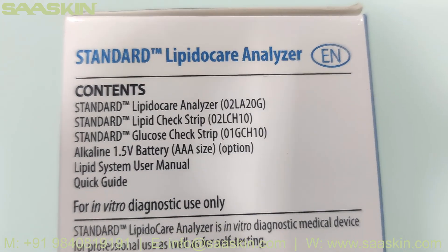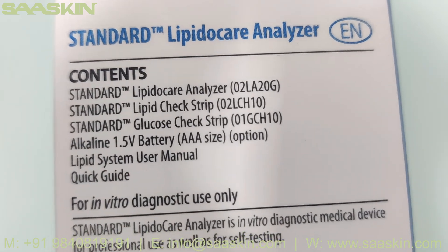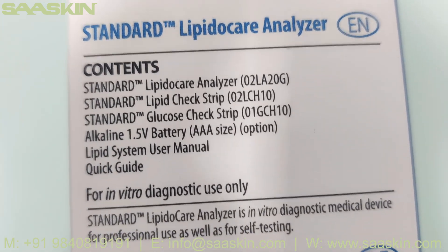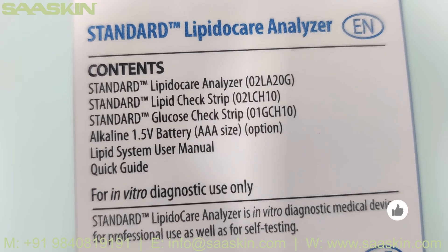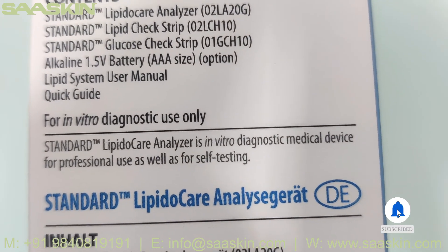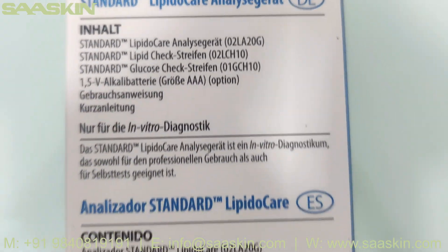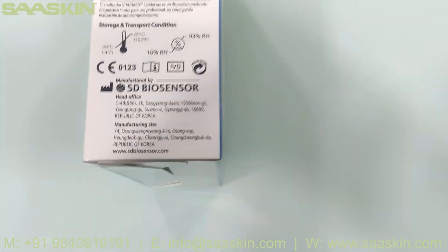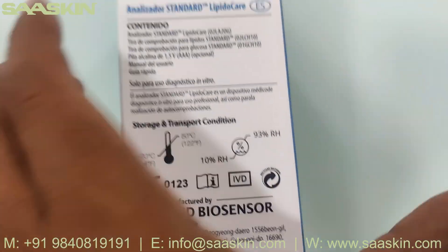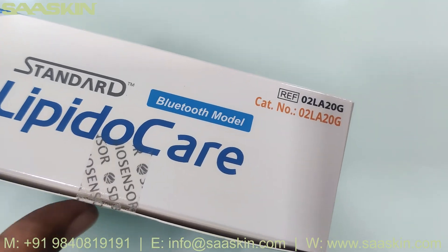Inside, look at the Standard LipidoCare analyzer contents: the Standard LipidoCare analyzer, the Standard Lipid Check Strip, and the Standard Glucose Check Strip. Batteries are also provided, along with the lipid system user manual. The Standard LipidoCare analyzer is an in vitro diagnostic medical device for professional use as well as for self-testing. It is a CE-IVD certified product manufactured by SD Biosensor from Korea.